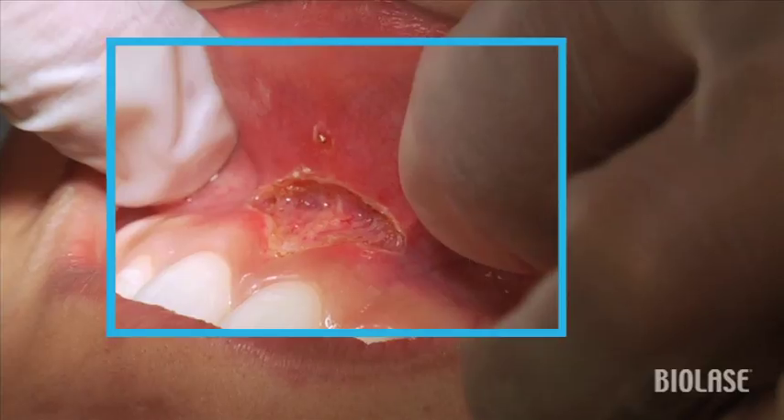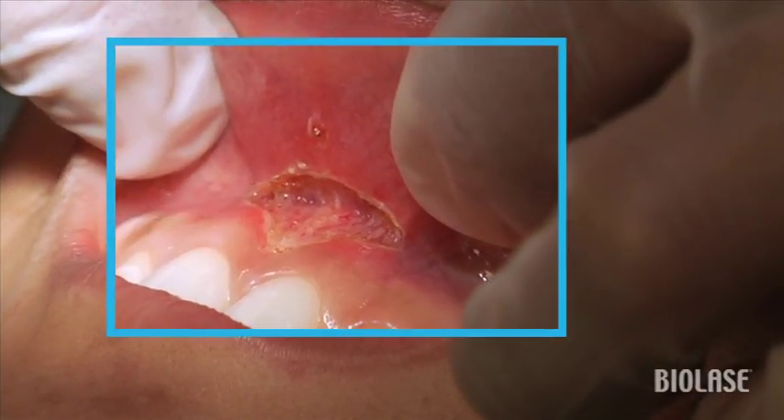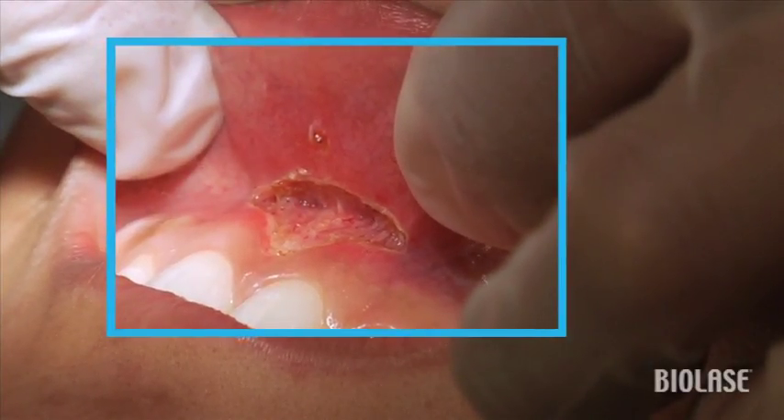Notice how nice and clean this is. Notice that there's no charring, no bleeding, and these are exactly the things that are going to help us achieve a very, very nice result postoperatively.